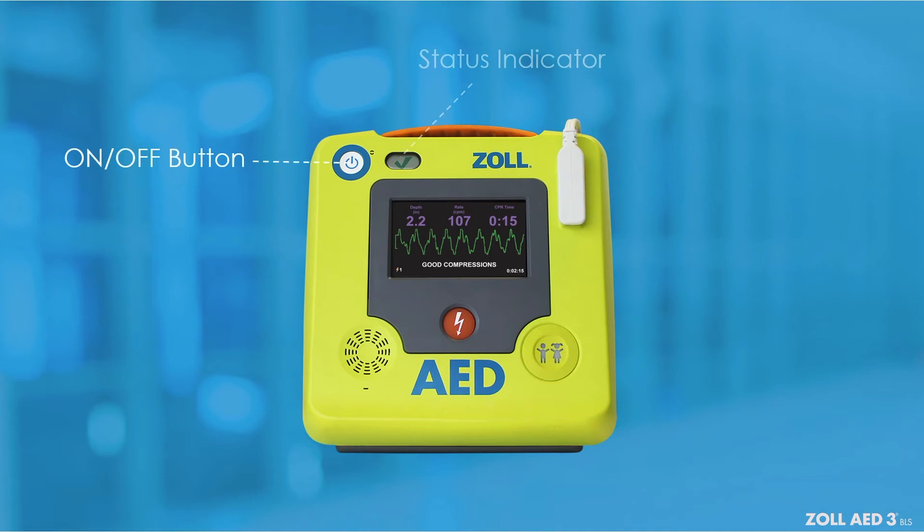The on/off button allows you to initiate your rescue with one touch. The defibrillation pads connector is used to attach the defibrillation pads to the Zoll AED-3BLS defibrillator.